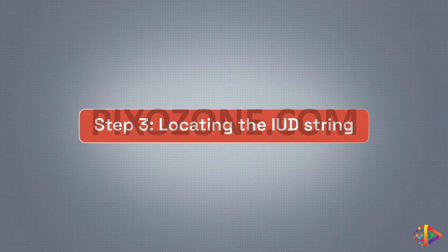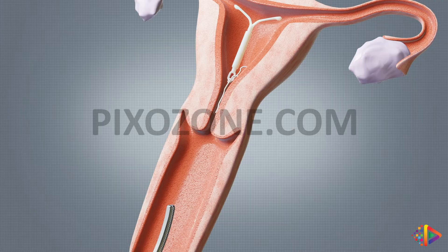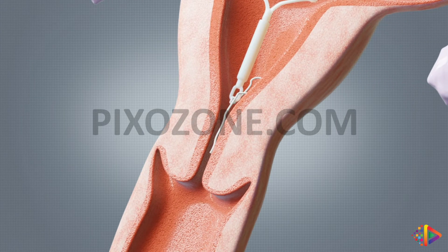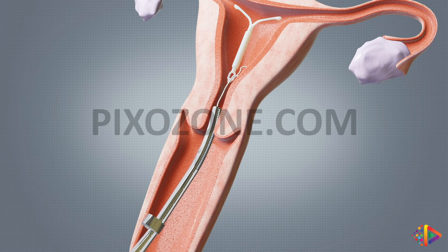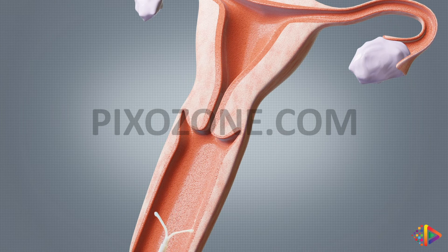Step 3: Locating the IUD string. The IUD's threads are typically found in the cervical canal or lower uterine cavity along the midline. Therefore, it's a good practice to begin your search in the upper part of the cervical canal. Advance the IUD remover into the cervical canal and open and close the jaws to search for the string of the IUD. Pull back gently to check if the device has been successfully grasped.